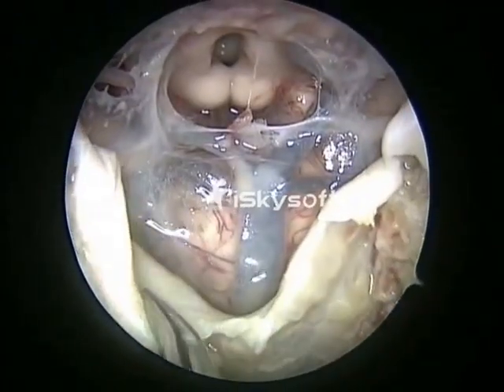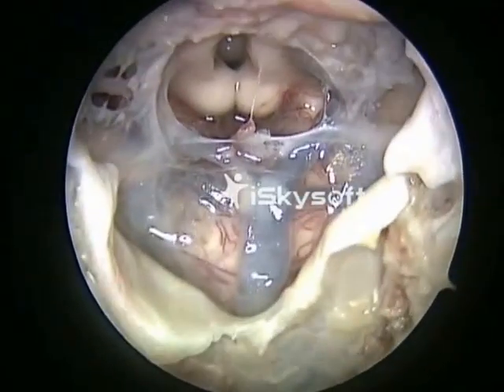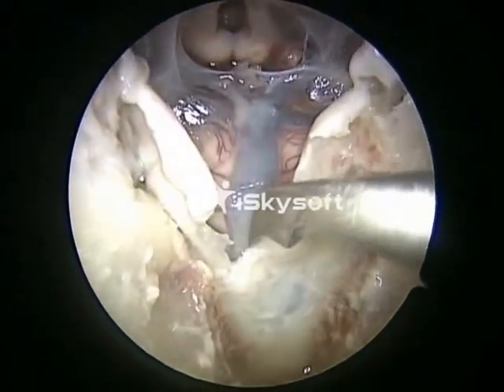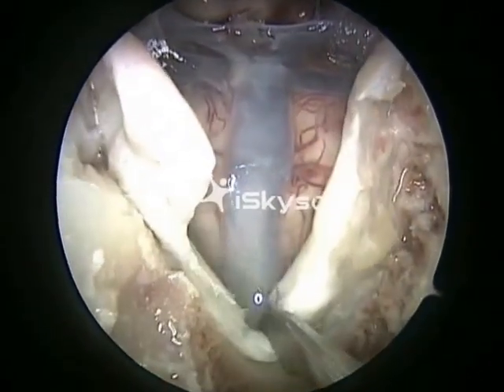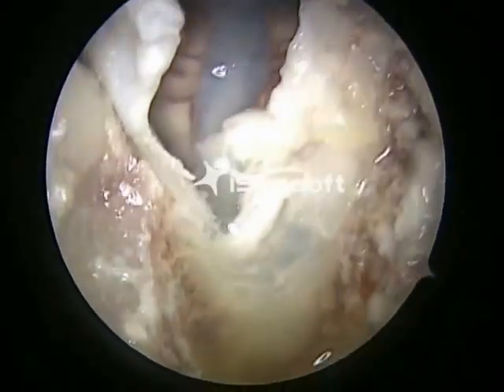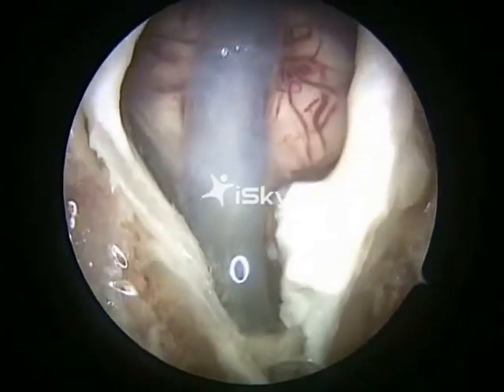It takes its origin at the level of the VBJ. That's the basilar artery coming into view. We are now using a sickle knife to cut further down. That's the dura being cut.